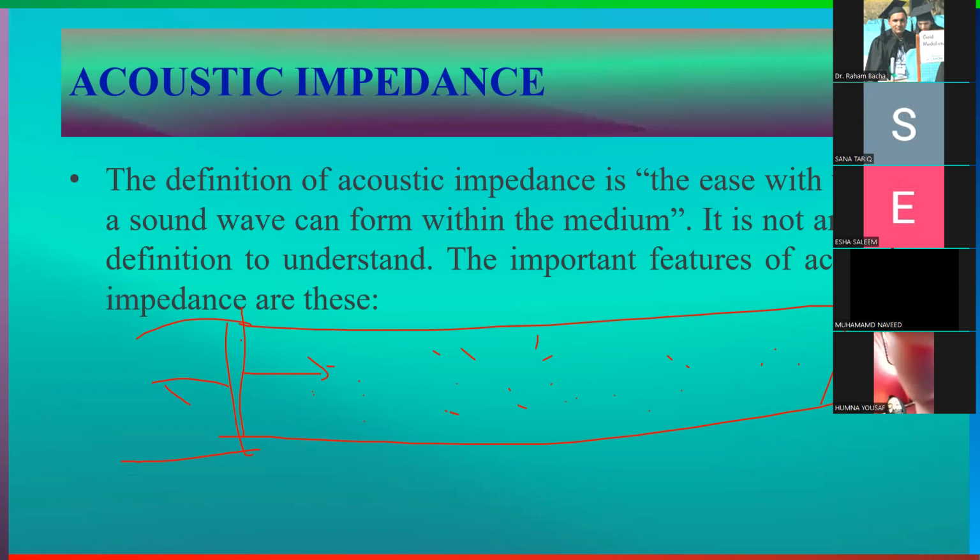Now, how are the sound waves forming in this medium? Because the sound waves are not particulate matter, just like X radiation passing through the body, but actually this is energy, and the sound waves are actually forming inside the medium. They are not introduced by anything else. These sound waves are generated inside the medium.